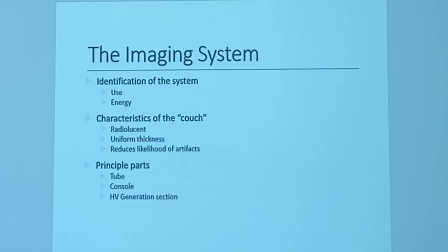All right, so the characteristics of the couch, the table that you put the patient on. I always put the couch in quotations because couch seems like it's comfortable. Have y'all gotten on these things yet? Mm-hmm. Yeah, I hope so. Just to get a perspective of what your patient has to go through.